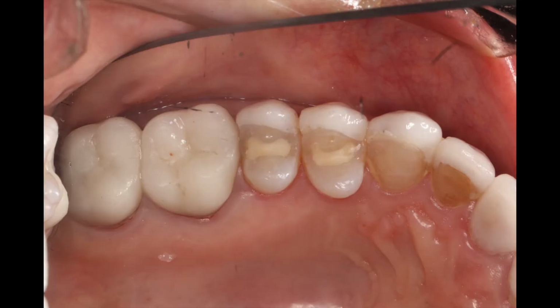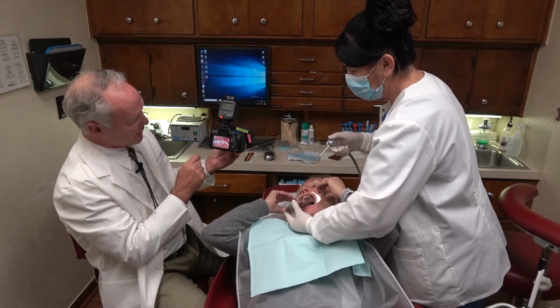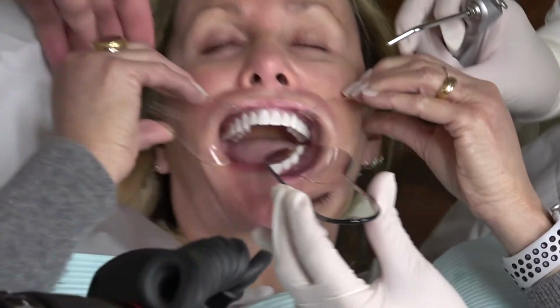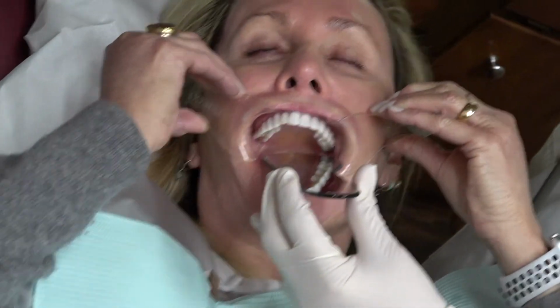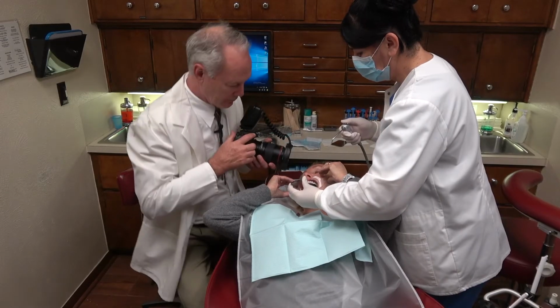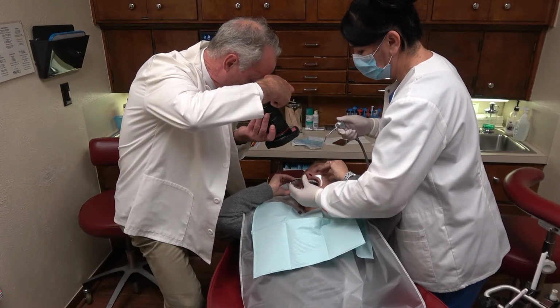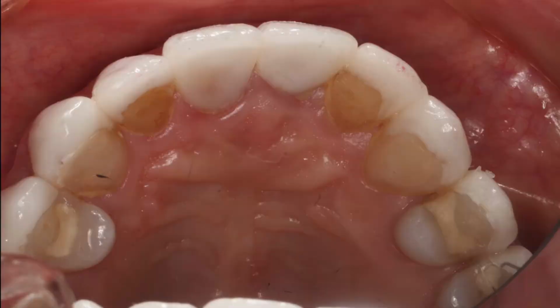And it's a right angle so I can see any cracks, leaky fillings, anything like that, okay? Now come up this way just a little bit, perfect. And this shows worn incisal edges.